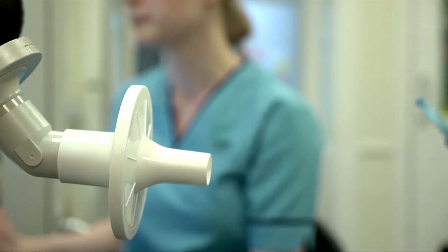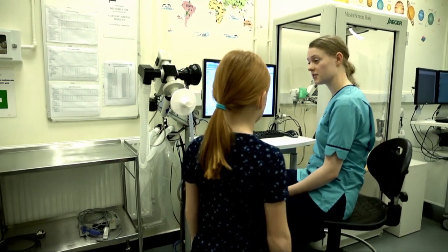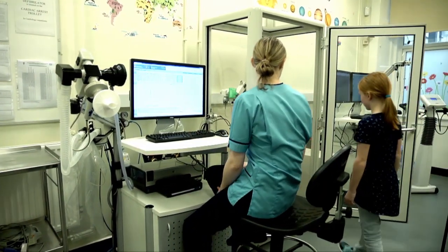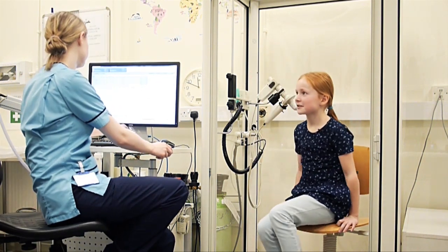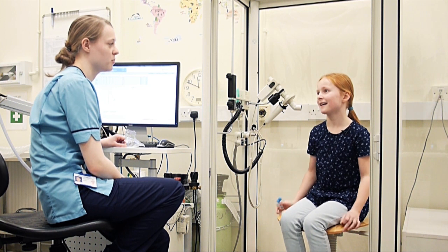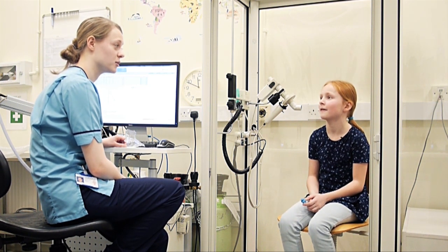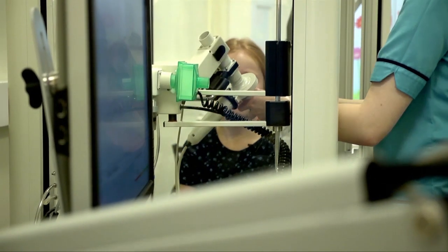Well done, that was good. That's us ready to do the next test now. So I'll get you to come across and have a seat in this box. This box looks a bit like a TARDIS — what is it for? Well, the box allows us to measure how big your lungs are and how well different parts of your lungs are working. So if you want to turn and face the other way and I'm going to put this mouthpiece in for you.